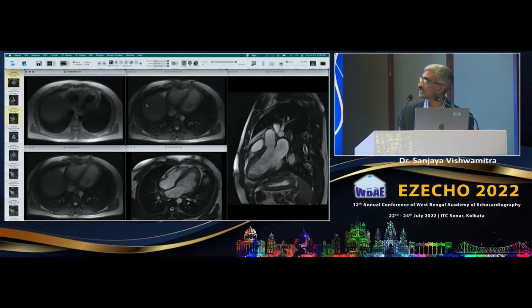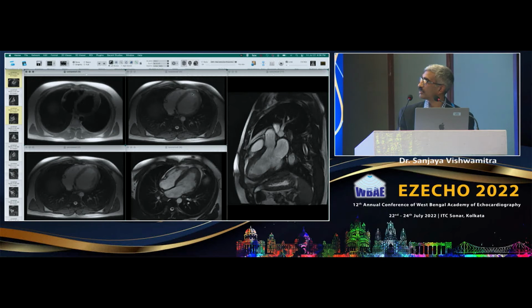And we use this to basically plan out our two-chamber views, and from the two-chamber views, we're then able to plan out the short axis views and the four-chamber views to get a double oblique projection of both. This also gives us the ability to look for additional findings, such as maybe a pericardial effusion or lymphadenopathy in these patients.